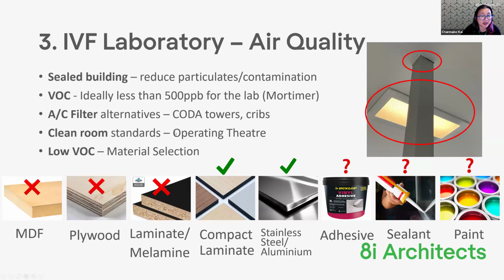So clean room standards, a lot of people think we need to have clean room standards. We're moving towards clean room standards, but there's still a lot of difference between IVF labs and clean rooms. We're moving closer and closer. The designs are moving closer and closer to clean room standards, but we're not quite there yet. Generally, if we try to keep it at the same level as operating theatres, that's considered acceptable at the moment. So with those exceptions about temperature and humidity, generally we'll aim to have the same level as operating theatres. But again, we've got the extra VOC requirements.